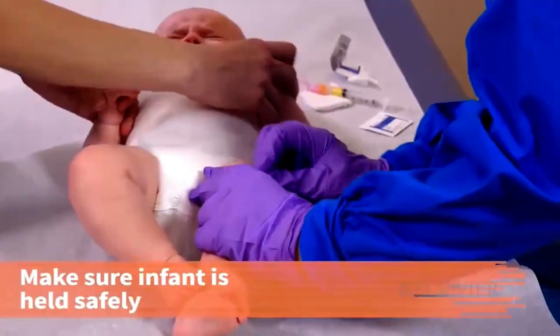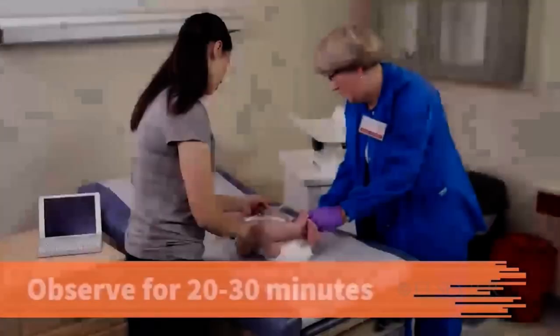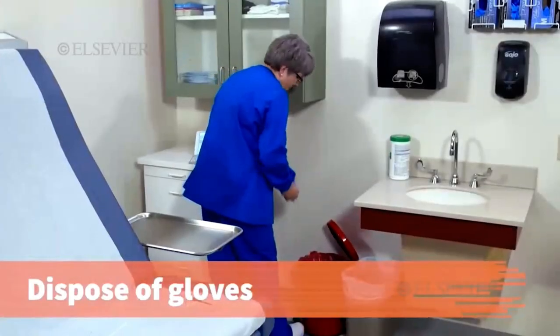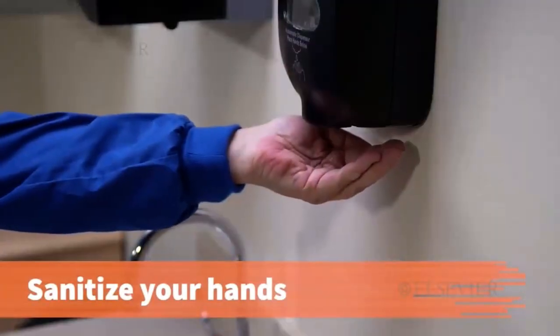Make sure the infant is safely held by the caregiver. Observe the patient for 20 to 30 minutes for any adverse reaction. Dispose of gloves and sanitize your hands.